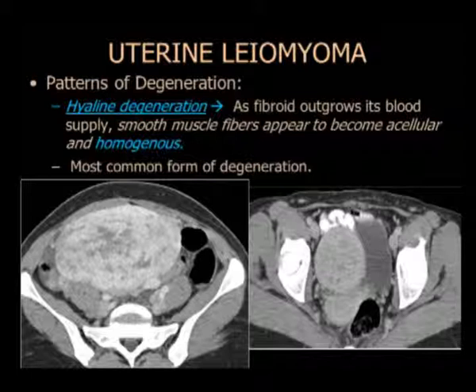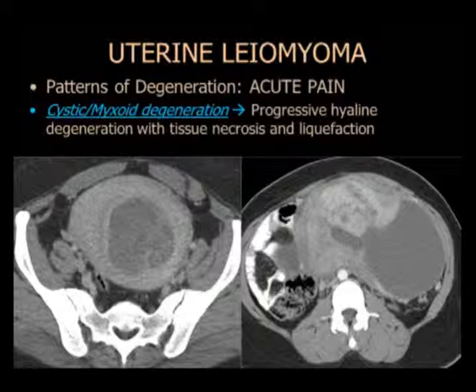Hay que conocer el aspecto normal de los fibromas uterinos y el tema de la degeneración. La degeneración hialina es la forma más común: se observan zonas que se licúan dentro del fibroma, con zonas lineales circundando áreas de disminución de atenuación tipo fluido. Cuando hay más licuefacción, empezamos a ver degeneración quística o mixoide. Estos son los que llegan a urgencias con dolor abdominal agudo. Si ven algo claramente quístico sin otra fuente de dolor, hay que informar fibroma degenerado con degeneración mixoide como posible fuente del dolor pelviano agudo.